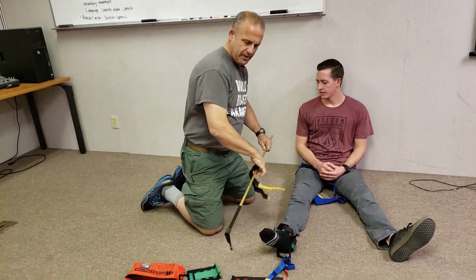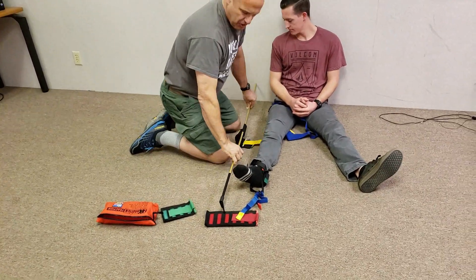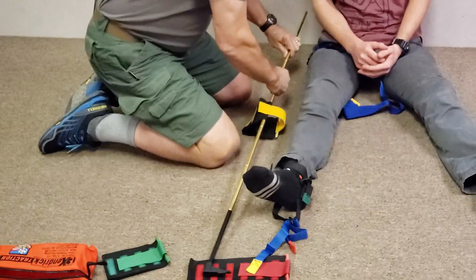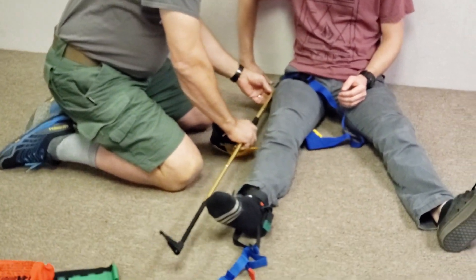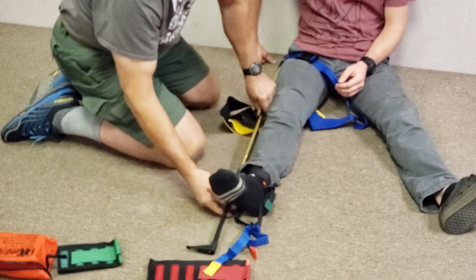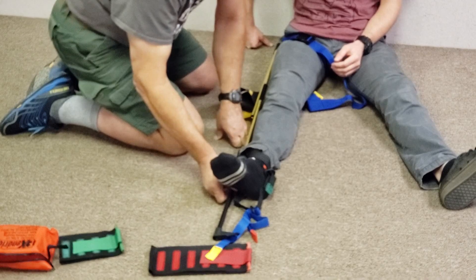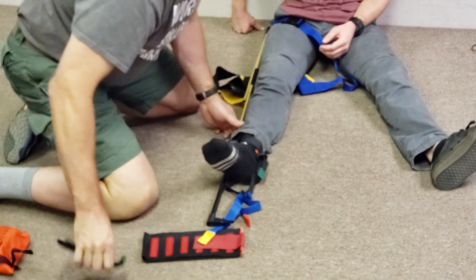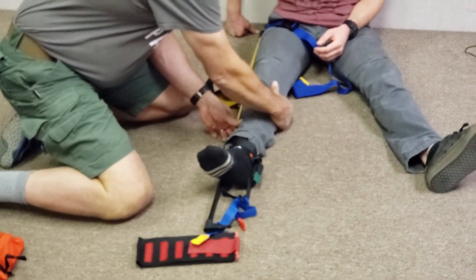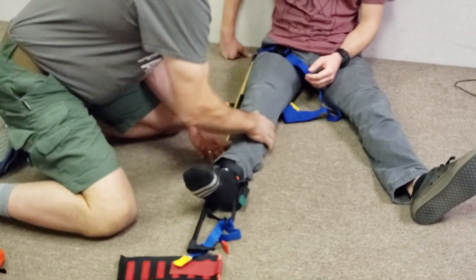Now set out the articulating rod and take your best guess on length. The end near the hip fits into the socket really well, and now you've created essentially the main structure.